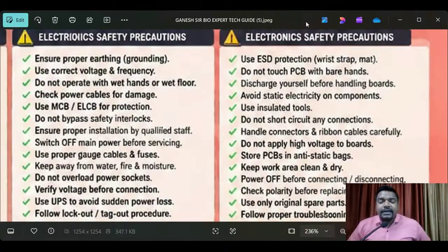I want to say, electrical is different and electronic is different. Electrical is based on power supply, and electronics is based on components. Those components have only limited specifications, and to activate all components, the electrical supply is very important. That is the reason SMPS converts AC to DC, so all components are DC components. That is the reason we have to follow the instructions as an engineering principle.